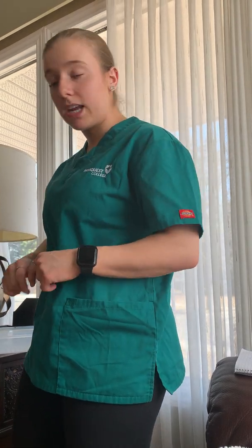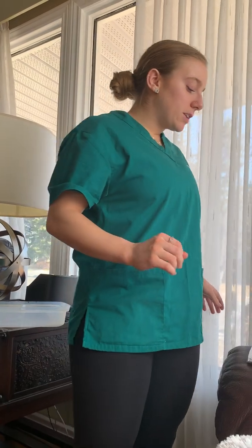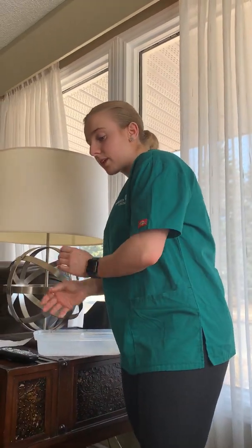As well, I will document that I have given them Humulin R on my medication documentation sheet by signing my name. And then I will ask the patient if they have any questions about anything else, make sure they're comfortable, provide privacy once again. The side rails are now up, bed is in the lowest position. I will then wash my hands. As well, in the beginning, I did forget to ask them for any medication or any allergies. So before administering any medication, make sure you do those things.